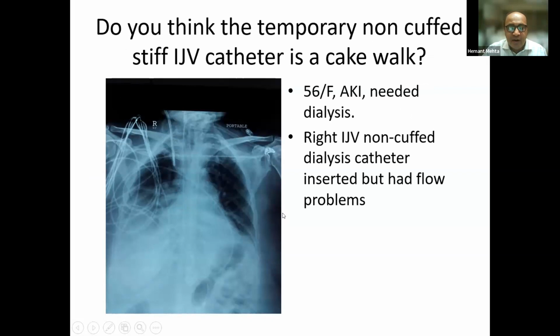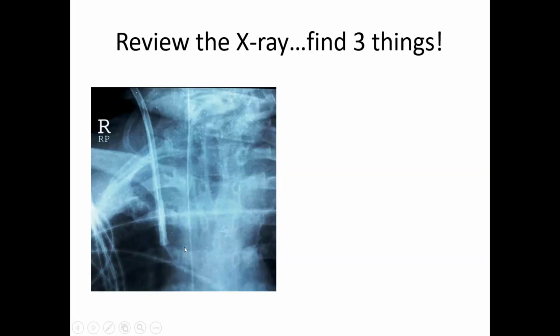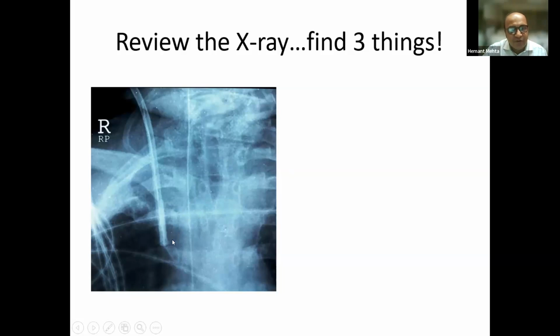It is blunt, and if you see carefully, something is jutting out here. Do you appreciate that? The J-tip, where my arrow is moving. I saw it immediately and realized what had happened.